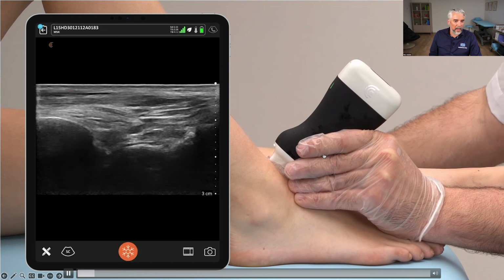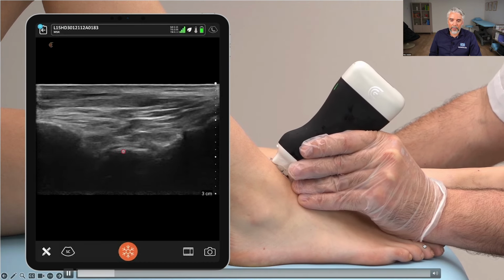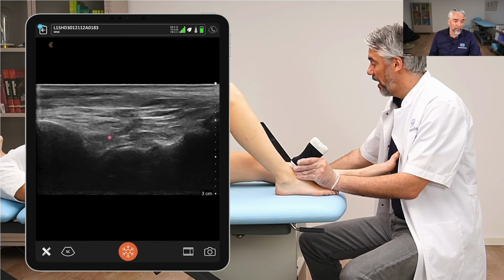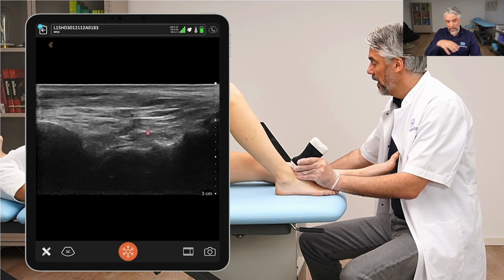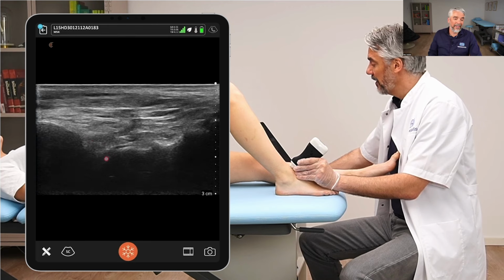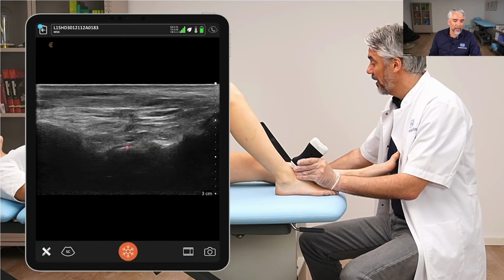So going to this slide, look at the transducer placement. It's on the ventral ankle joint, and from there on, we're going to sweep from medial to lateral. Here we can see the capsule, like curtains on the joint, and also with a capsular fringe within the joint.